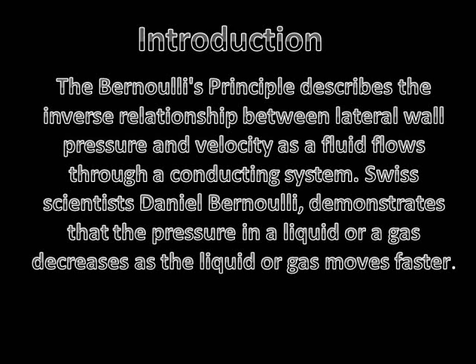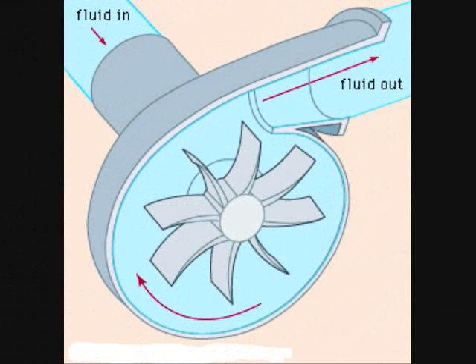Bernoulli's principle describes the inverse relationship between lateral wall pressure and velocity as a fluid flows through a conducting system. Swiss scientist Daniel Bernoulli demonstrated that the pressure in a liquid or a gas decreases as the liquid or gas moves faster. This is a picture of a centrifugal pump.